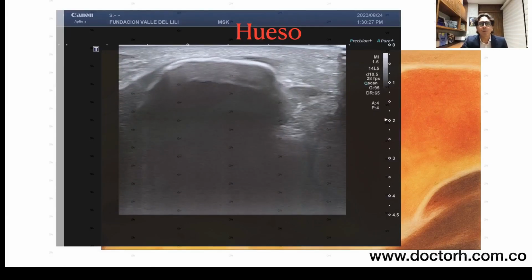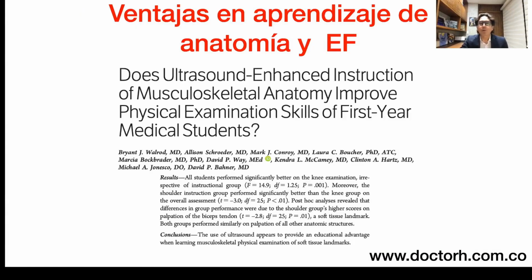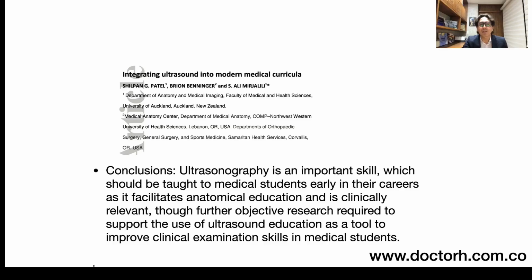When we looked into whether it was worth implementing, we found that nowadays reputable universities have documented and written about the clear advantages in learning anatomy and physical examination. Terms like palpating with your eyes have even been coined, because ultrasound allows us to expand our ability to perform physical examinations.